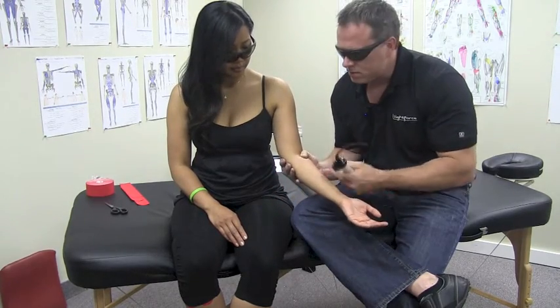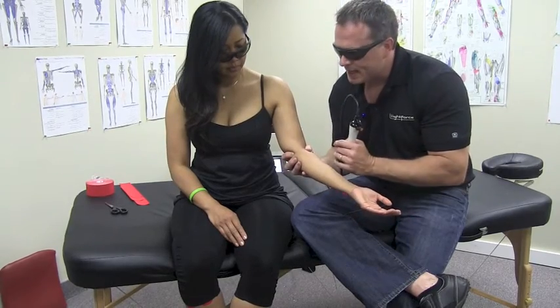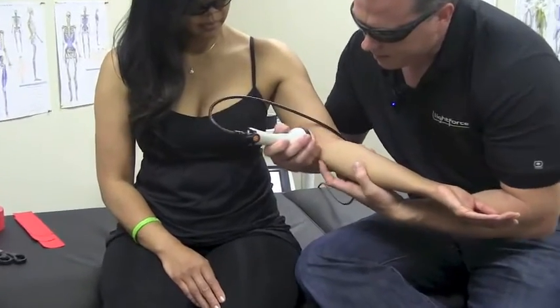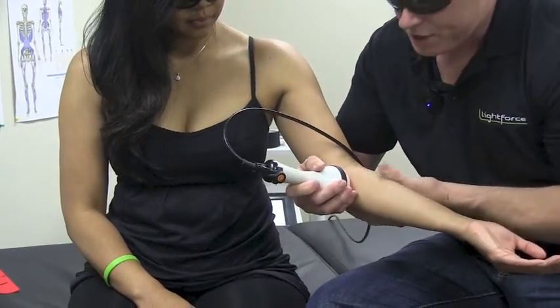If I'm dealing with medial epicondylitis, or golfer's elbow, it's the same exact technique, but now I'm going on the inside. I'm going to cradle it right around the ulna, do my isolation, and then apply the counter pressure this way.